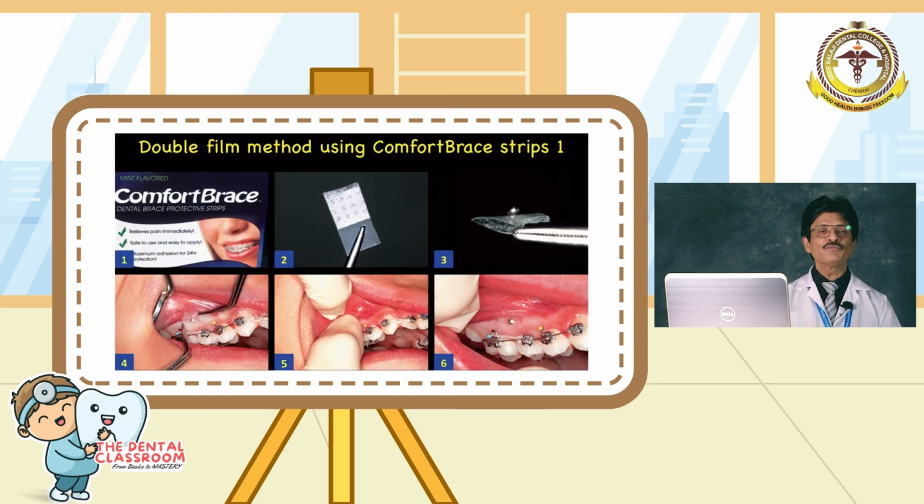So certain people, instead of using the canker sore patch, used the comfort brace. The technique is almost the same.